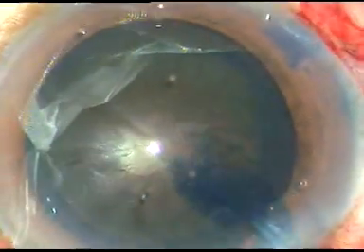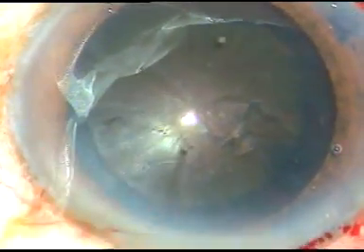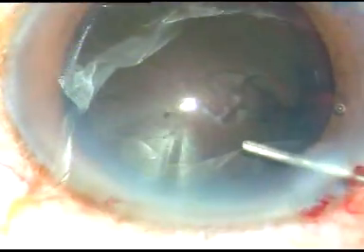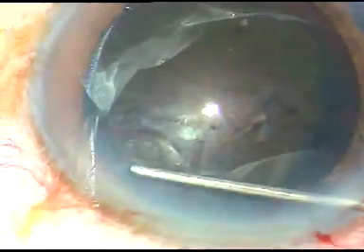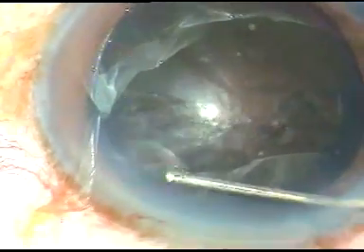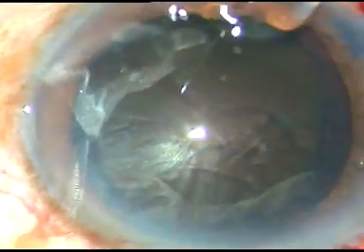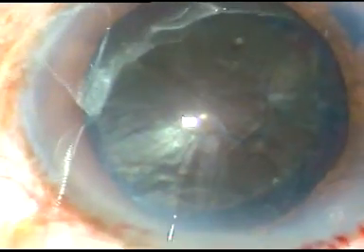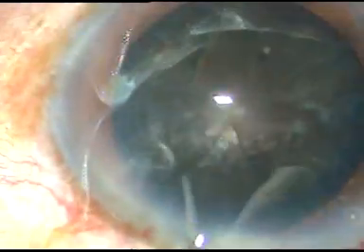If we do large rhexis in hard cataracts, management of the nucleus will be easier and zonular stress will be less. Now see hydrodissection at multiple points — the nucleus is tapped gently and it is rotated.